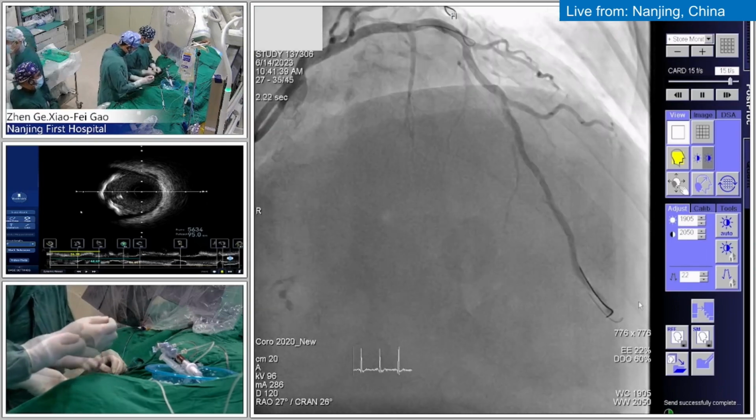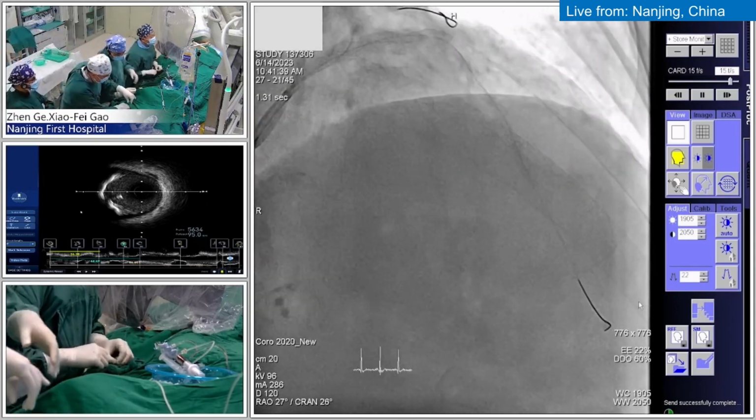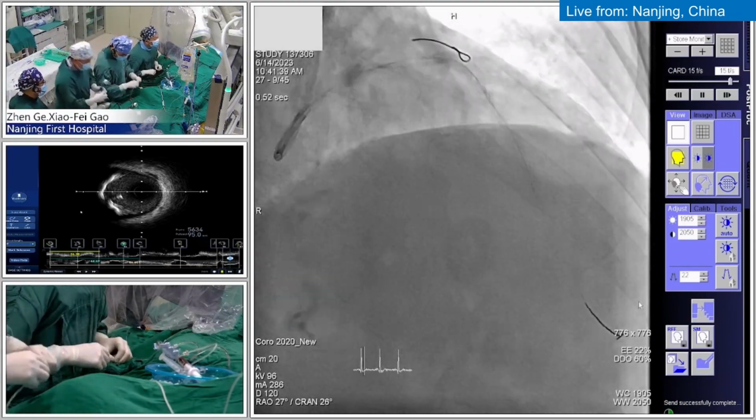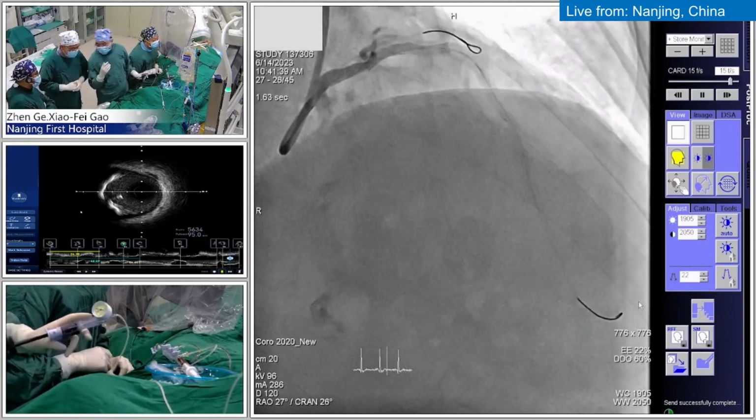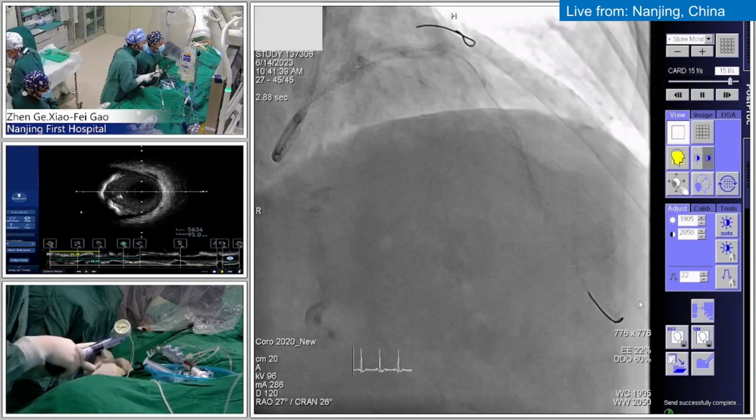That looks very good there. You're making excellent progress. I thought a slight dissection or something at the distal 3.5, and then the first 4.5 diagonal. Yeah, exactly. That would be the right way to do it.